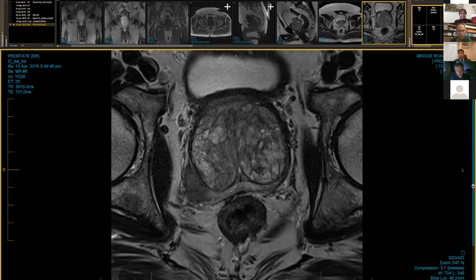I would agree that's really obvious. That's a large area of extraprostatic extension in that pathology picture I showed you as well. And so when we've discussed this at our meetings, we are usually, as Richard said, dealing with extraprostatic extension with a radial extension somewhere in the order of, you know, under 1.5 millimeters.